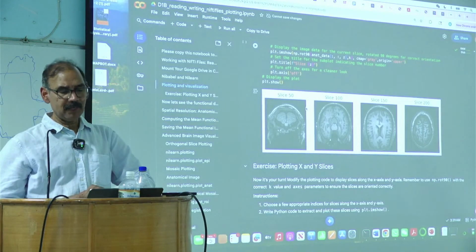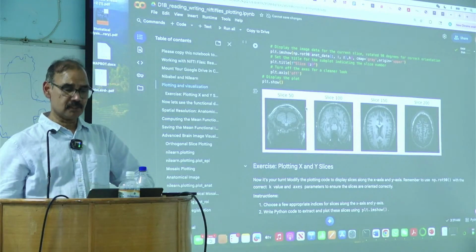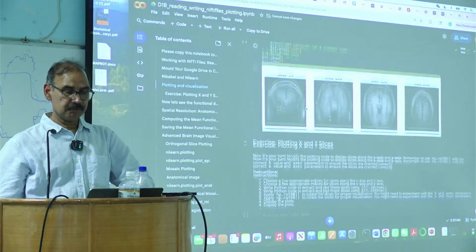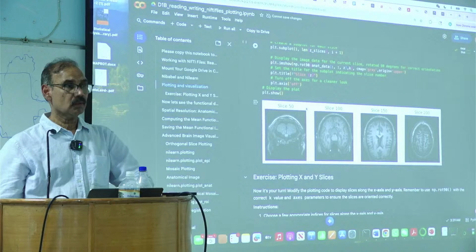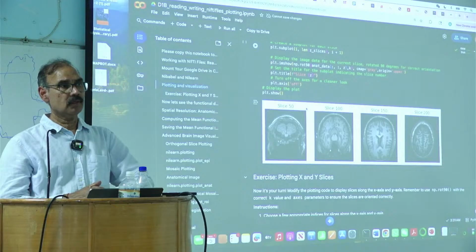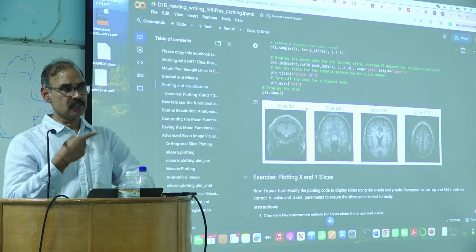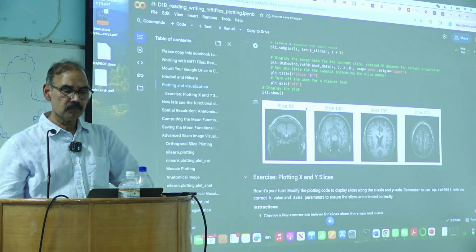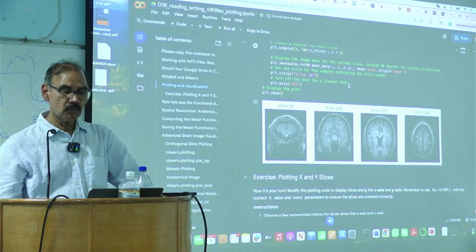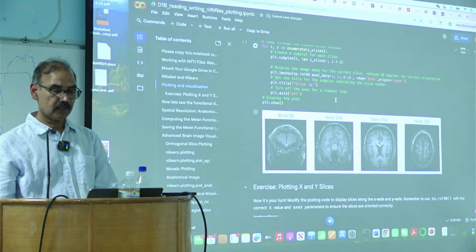Right, so sometimes we try to have an index, but I don't think it is necessary for this one. So K is multiples of 90. Okay.